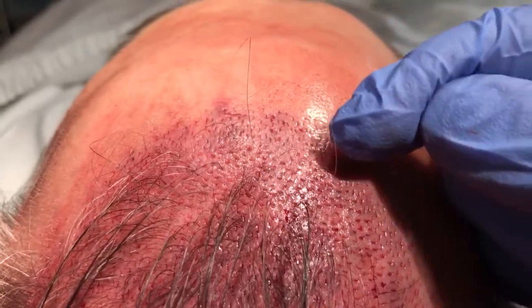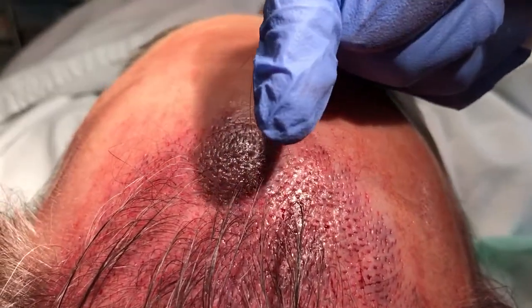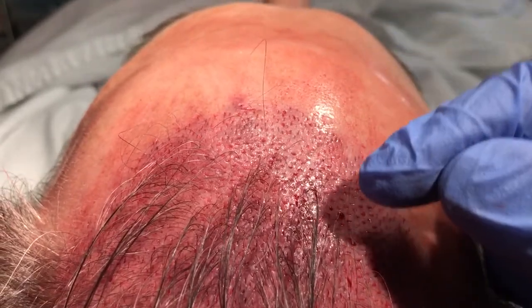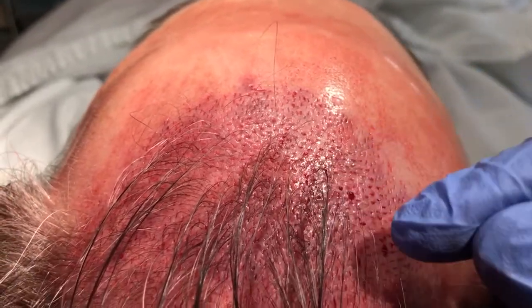Hairlines are made with sagittal sites. Sagittal sites mean they're made like this with a needle. The reason for that is they give me a lot better angulation in the front so that the hairline looks more natural. I can control the directionality of the hairline.